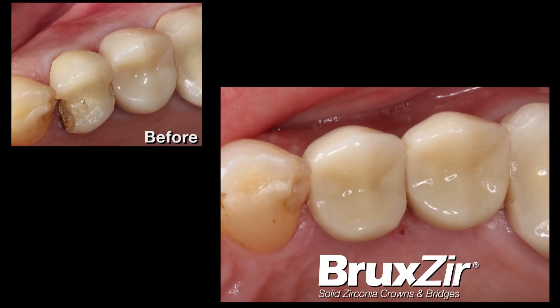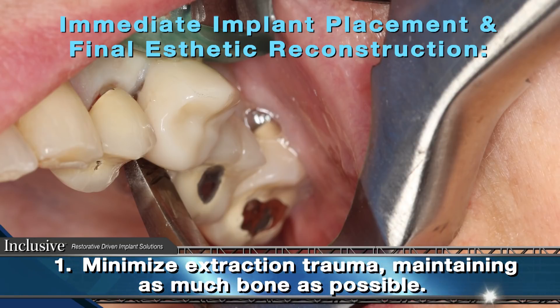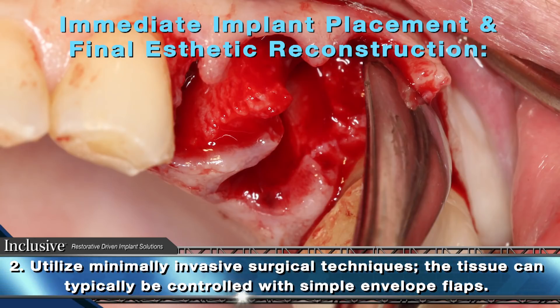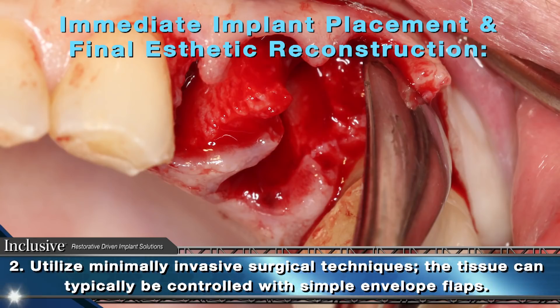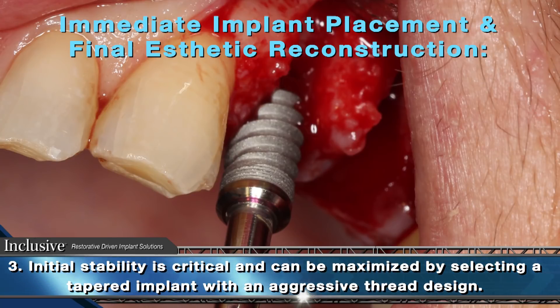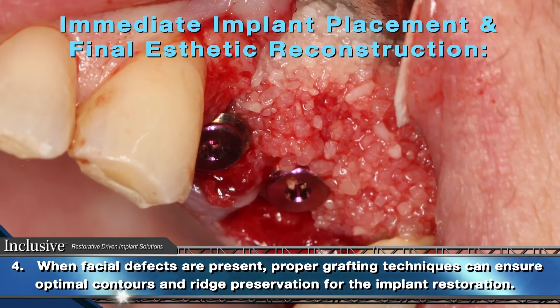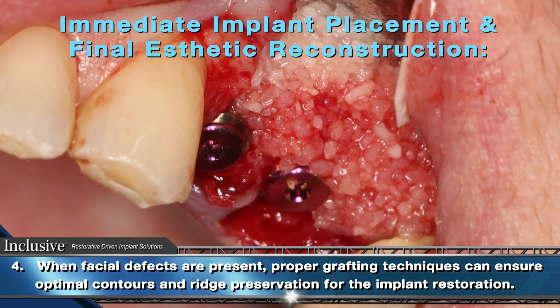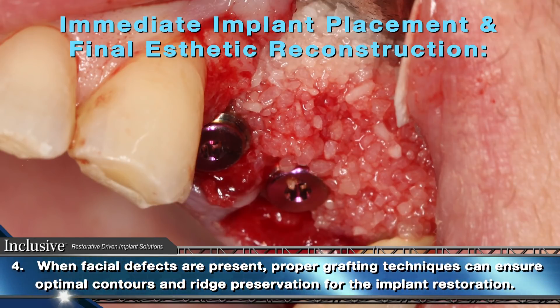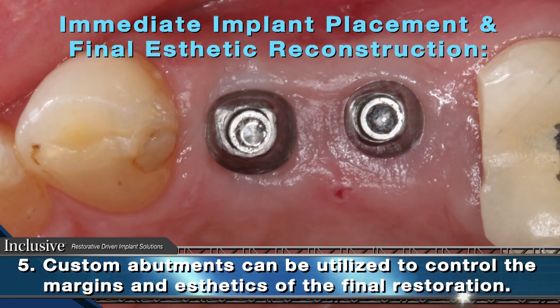In conclusion, the most important aspects of immediate implant placement and eventual final aesthetic reconstruction can be summarized as follows. Number one: minimize extraction trauma — maintain as much bone as possible. Number two: utilize minimally invasive surgical techniques; the tissue can typically be controlled with simple envelope flaps. Number three: initial stability is critical and can be maximized by selecting a tapered implant with an aggressive thread design. Number four: when facial defects are present, proper grafting techniques can ensure optimal contours and ridge preservation for the implant restoration. Number five: custom abutments can be utilized to control the margins and aesthetics of the final restoration.